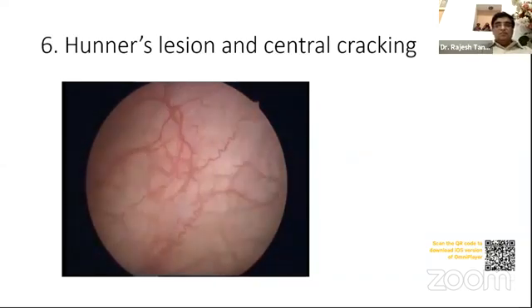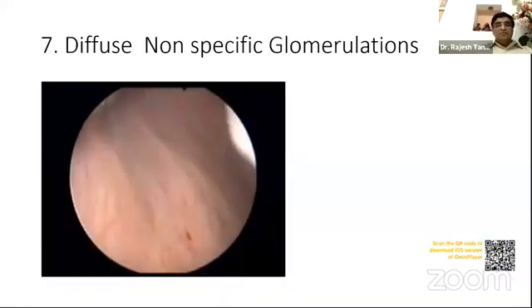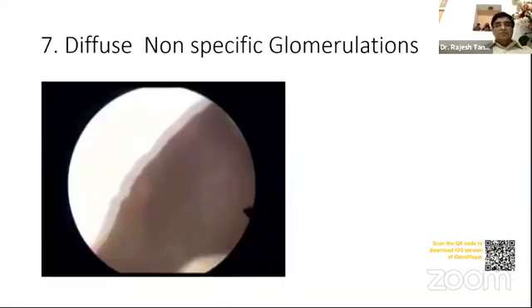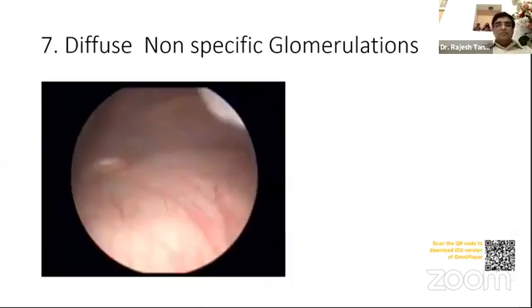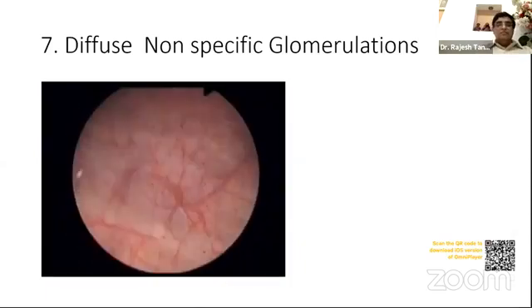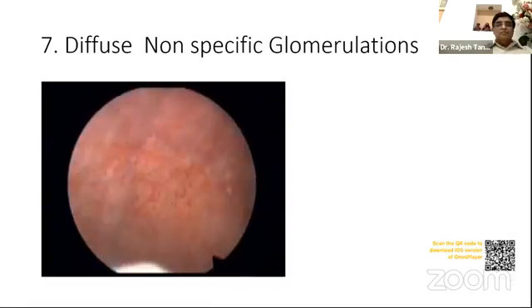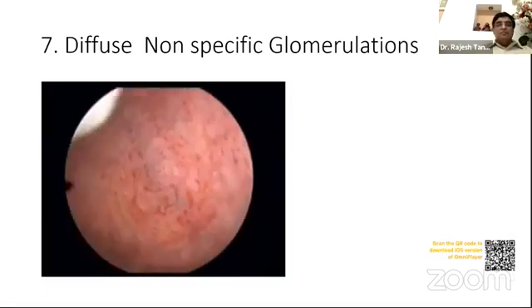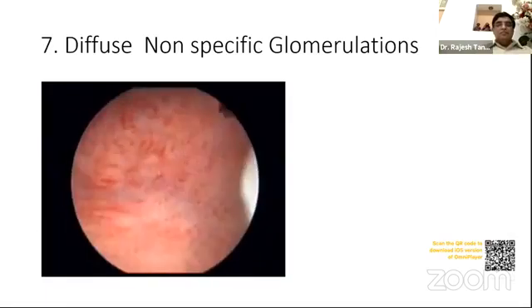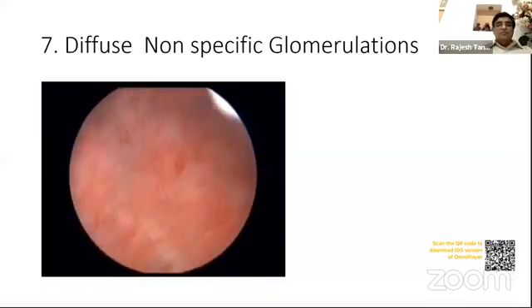Note the central cracking of the lesion upon hydrodistension; the rest of the bladder does not show any cracking. This case depicts non-specific glomerulations which are diffusely occupying the distensible part of the bladder. Note that this is a non-specific finding and is not diagnostic of BPS/IC.